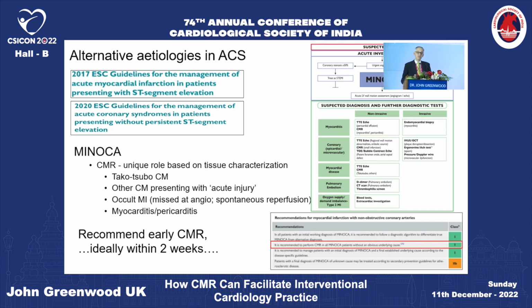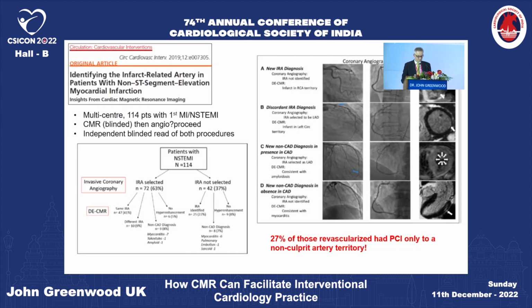But the earlier you do the test, the more likely you are to find the abnormalities before there's been any healing and resolution. So it's good to try and do the test as early as possible. Now here's a really interesting study.